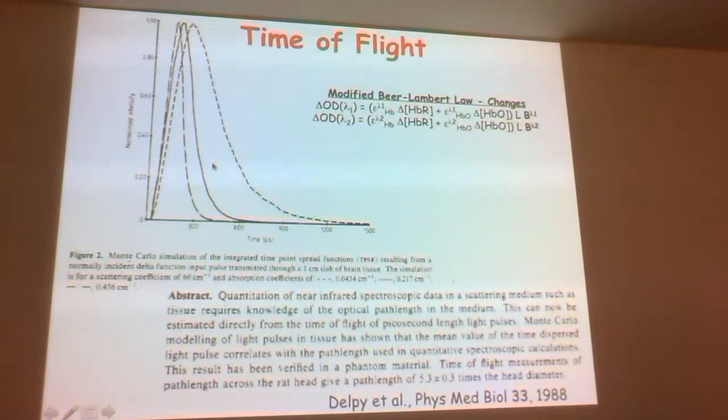through tissue. So he made measurements with different source detector separations. He got what the average path length of light through the tissue was, and he was able to use those measurements to figure out what this differential path length factor should be so that they could use their simpler CW measurement and analyze changes in oxygenated and deoxyhemoglobin, right? So they weren't going to use this system in clinical measurements because you needed 3 physicists to operate the instrument. So they used it to really calibrate the simpler CW system.